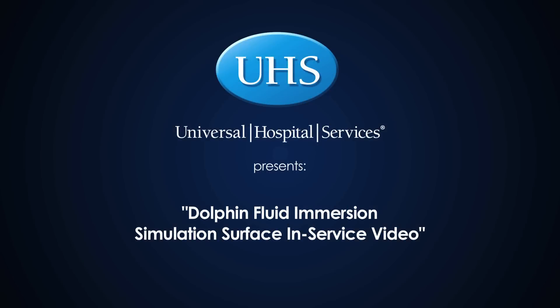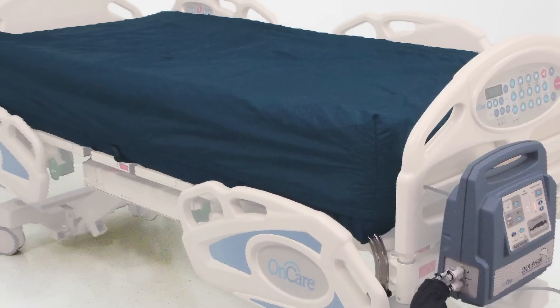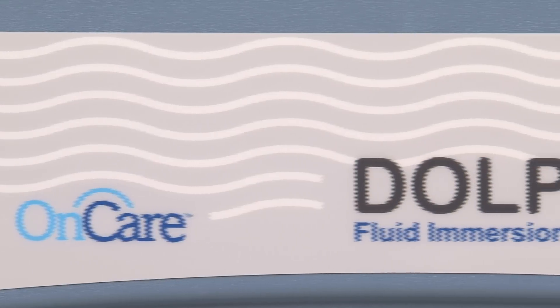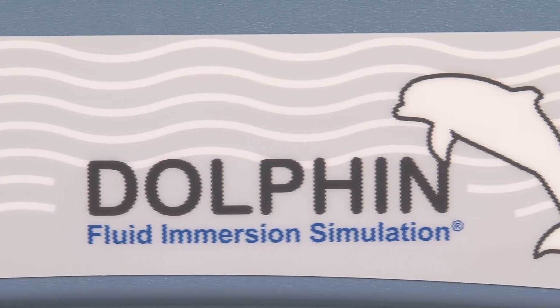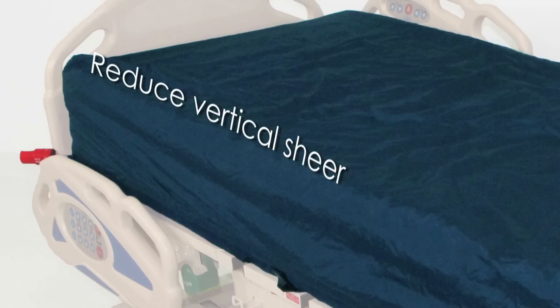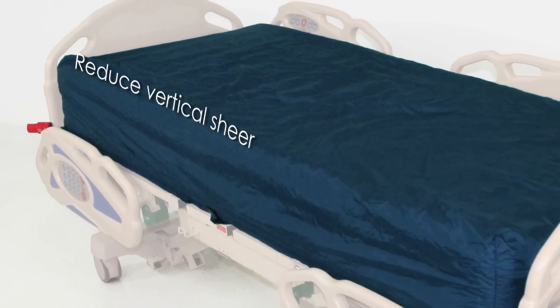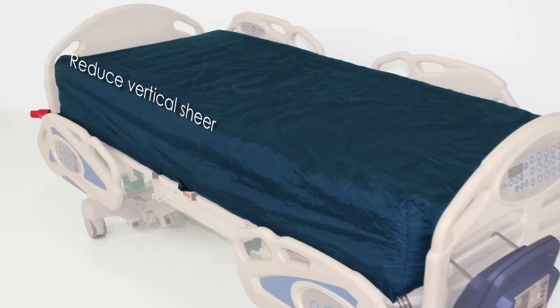Universal Hospital Services is pleased to present the following in-service of the Dolphin Fluid Immersion Simulation Surface. Initially developed for out-of-water transport of dolphins and seals for the U.S. Navy, the OnCare Dolphin Fluid Immersion Simulation Therapy Support System mimics buoyancy with 3D volumetric engagement of the patient, resulting in decreased vertical shear on the patient to minimize soft tissue deformation and maximize blood flow.